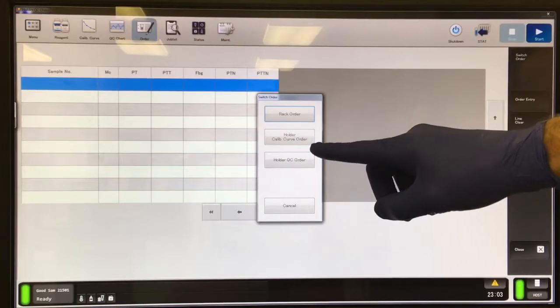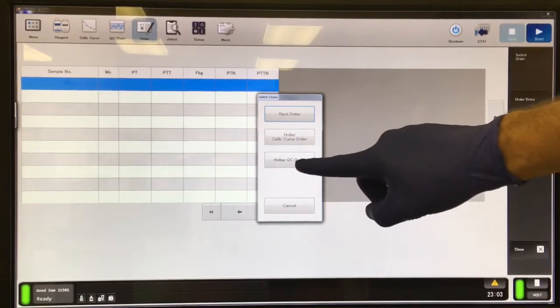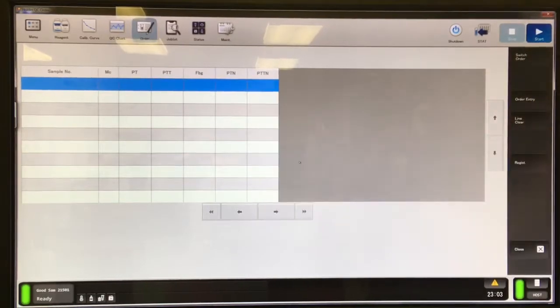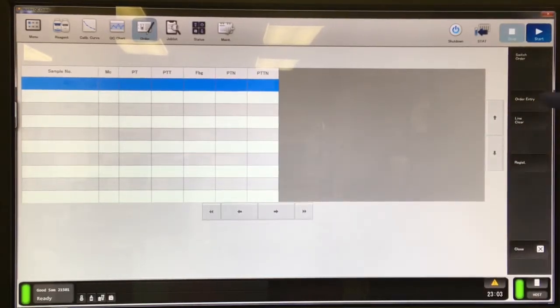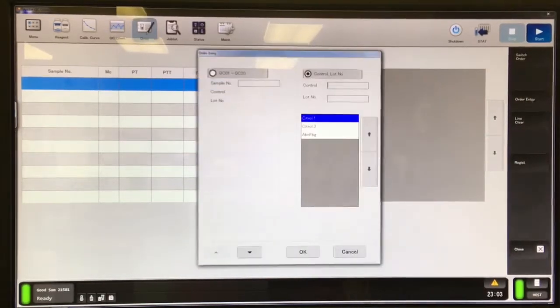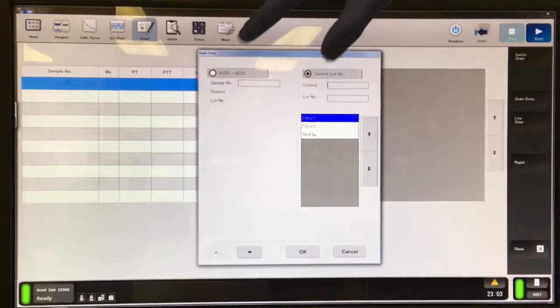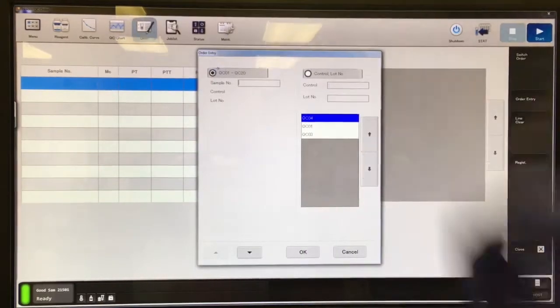If you're in rack order mode, you'll want to switch it to holder QC mode, and then from here, go ahead and select order entry.